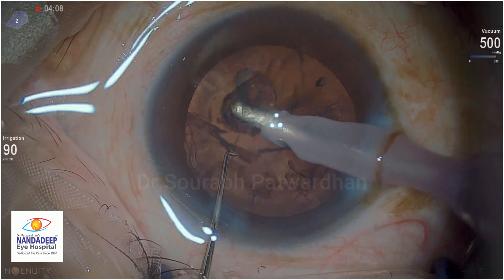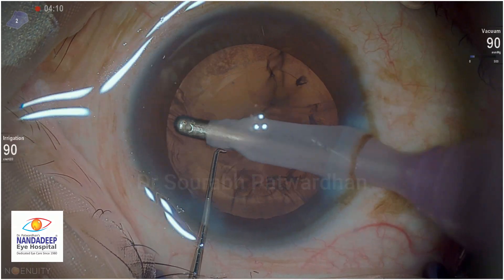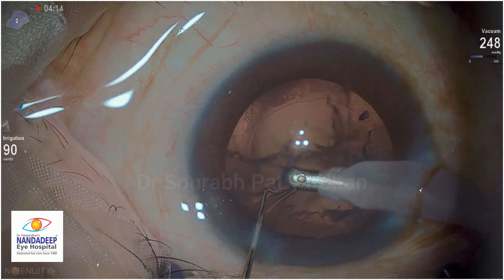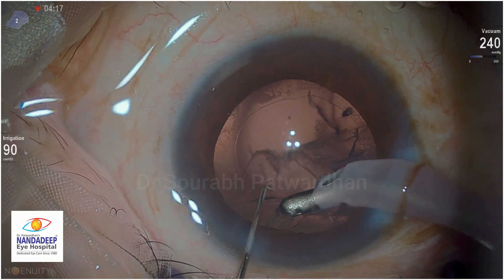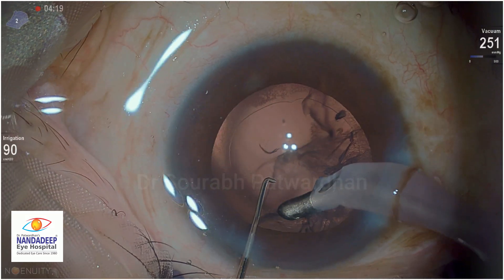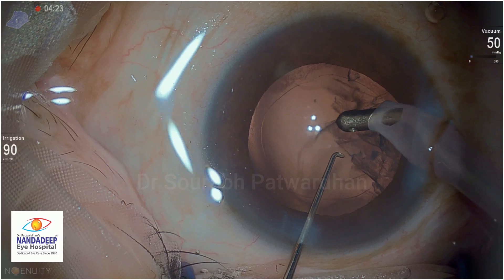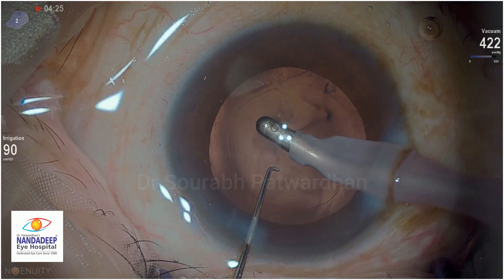Now I am doing cortex aspiration in vacuum mode - that's why you cannot see the flow rate there. It is basically venturi mode which I am using here. You have the option of using either venturi or flow based on the steps and based on the speed at which you want to proceed with the things intraocularly.